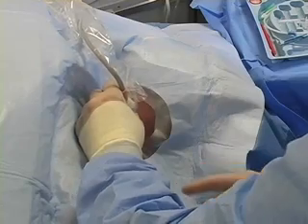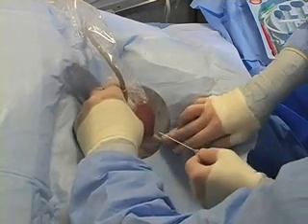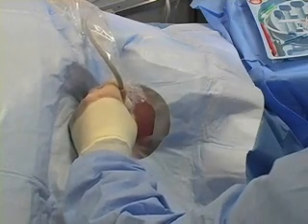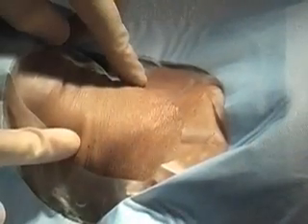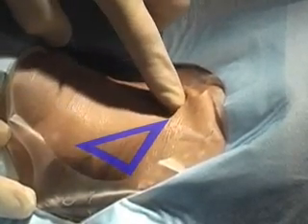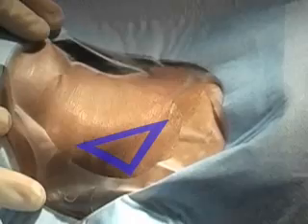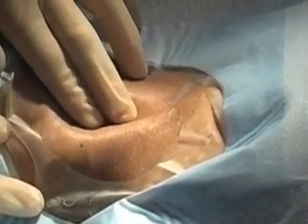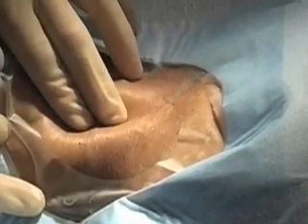During the placement of the line, any assistant or observer should feel empowered to halt the procedure if there is a break in sterile technique. Confirm the needle insertion site again. Generally, it is at the apex of the triangle, just lateral to the carotid pulse. During needle puncture, palpation of the carotid artery can be maintained with the non-dominant hand.